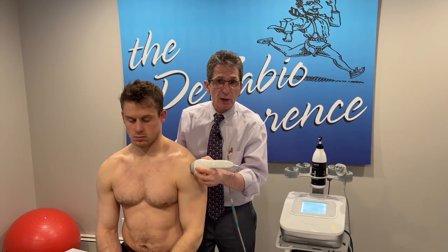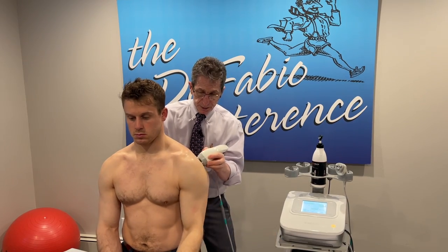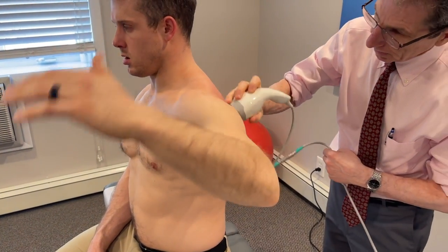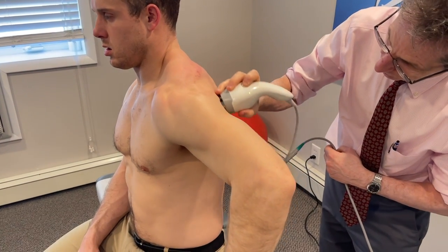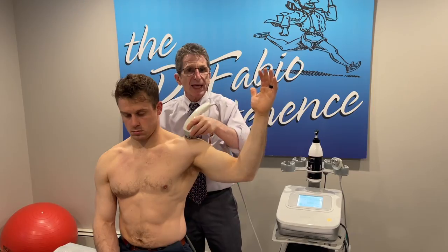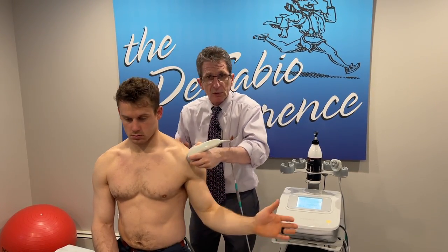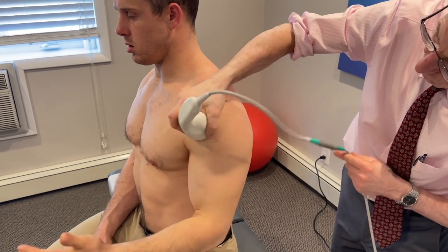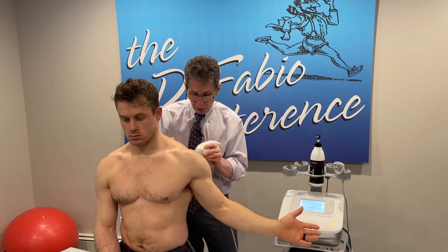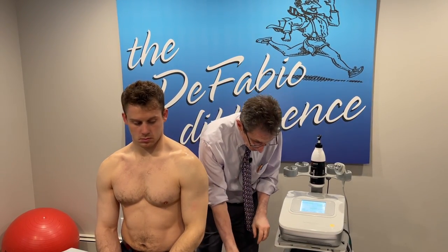I love this for arthritic joints — thumbs, shoulders, internal and external rotation. Bring it up and then give me internal and external rotation. This is fabulous; it's our money punch for arthritic shoulders. Now, if they can't go up here because the shoulder's too stiff, we have them do internal and external rotation down lower. Check out my YouTube video on Ed's story — he did fantastic. Look at the bone spur he had. That's mix mode: both RET and CET at the same time.